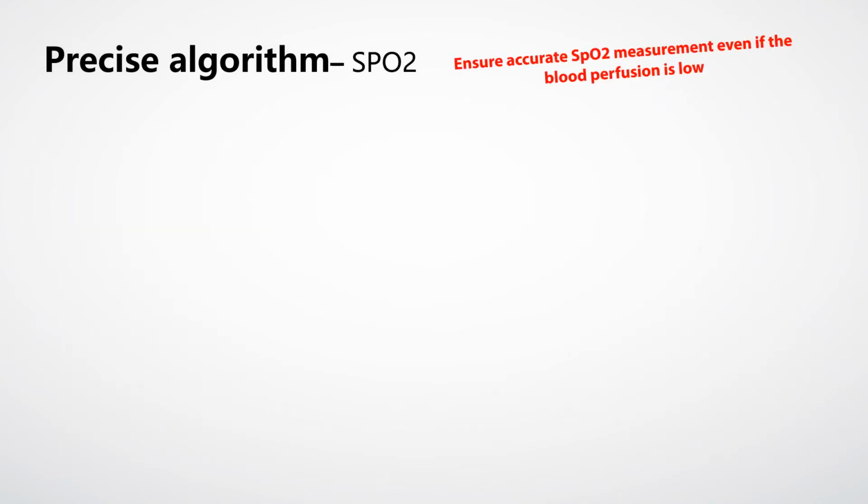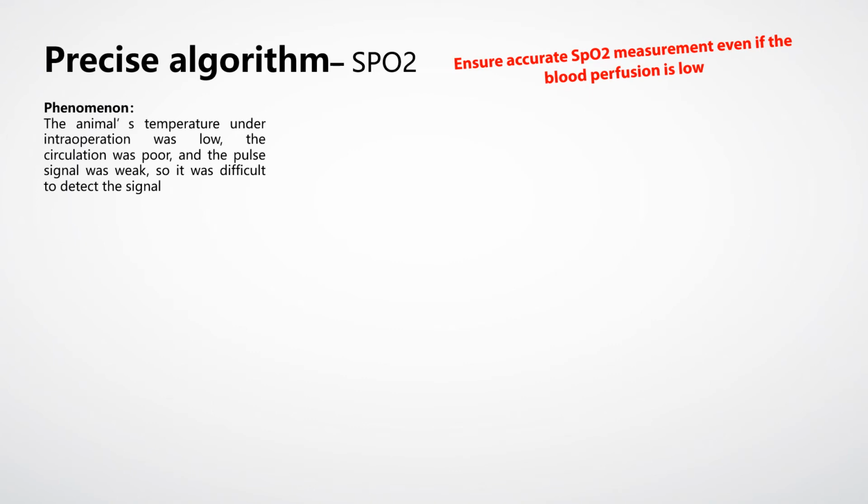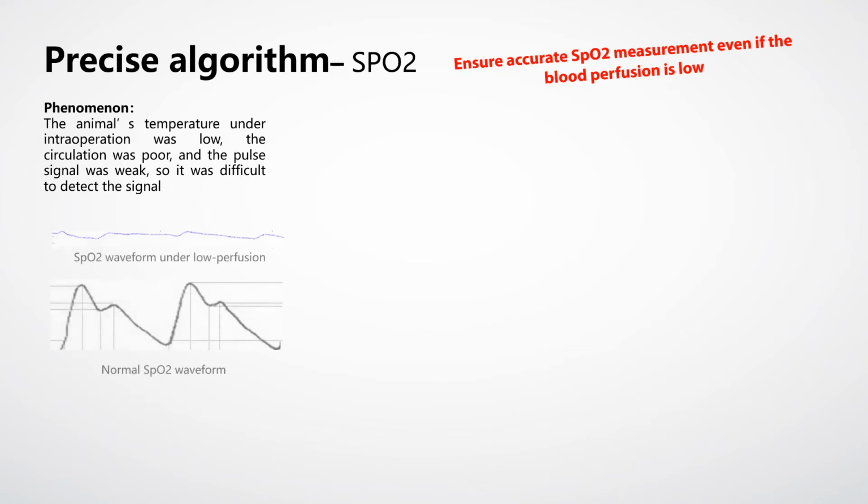Next, let's see the SpO2. For animals, the temperature under surgery is low, the circulation is poor, and then the pulse signal is weak. So it is difficult to detect the SpO2 signals during this time.